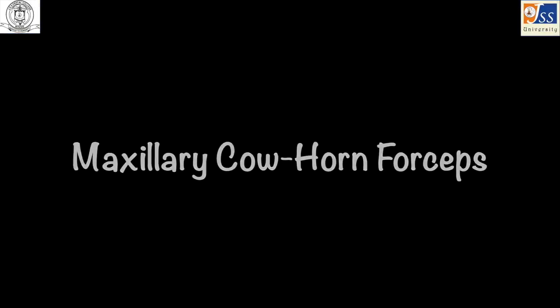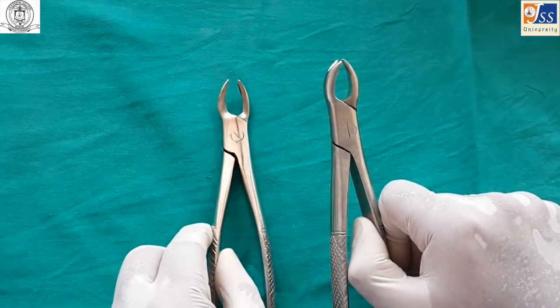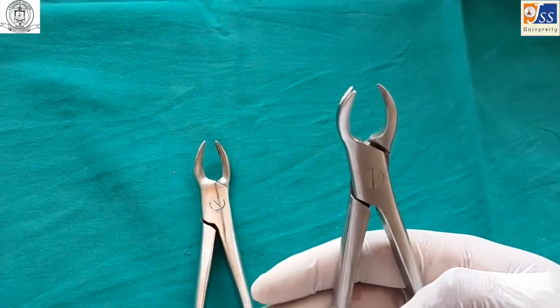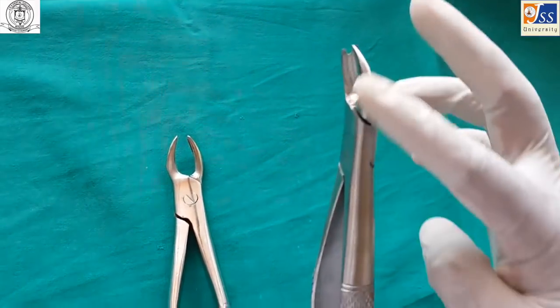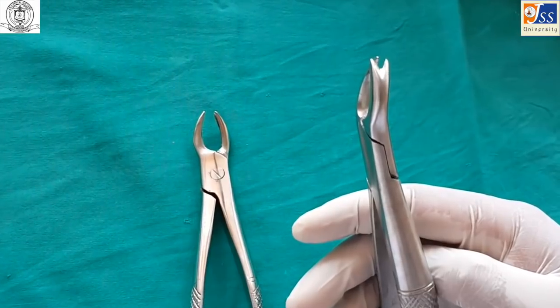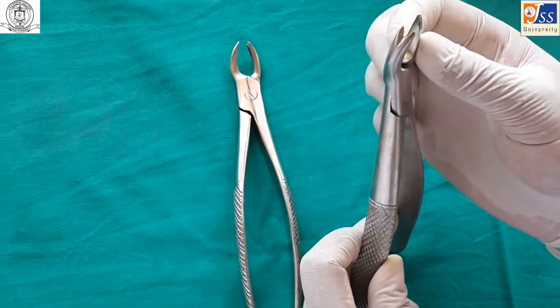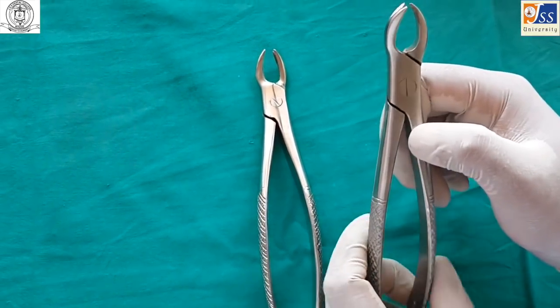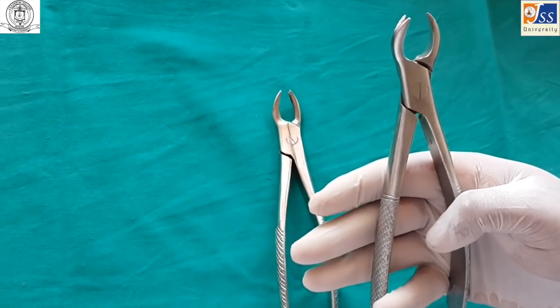The maxillary cow horn forceps is used for maxillary molars and is a paired instrument, one for the left and one for the right side. It is especially used for extraction of grossly decayed teeth which cannot be gripped by the standard maxillary molar forceps. There is a single conical beak which engages the buccal furcation area, determining the side of the forceps, while the other beak has two prongs which engage the palatal root.